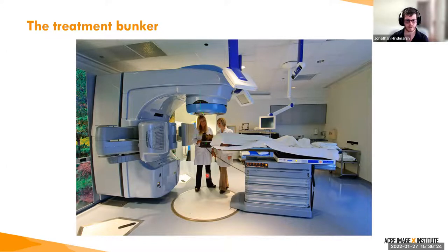We have our therapists setting up the patient here, our linear accelerator with a KV imaging system off perpendicular to the main beam line. This also has a stereotactic imaging system. So this panel here pairs with this source, and this source back here pairs with this panel here, and they are used for imaging the patient during treatment. It's a third party system.